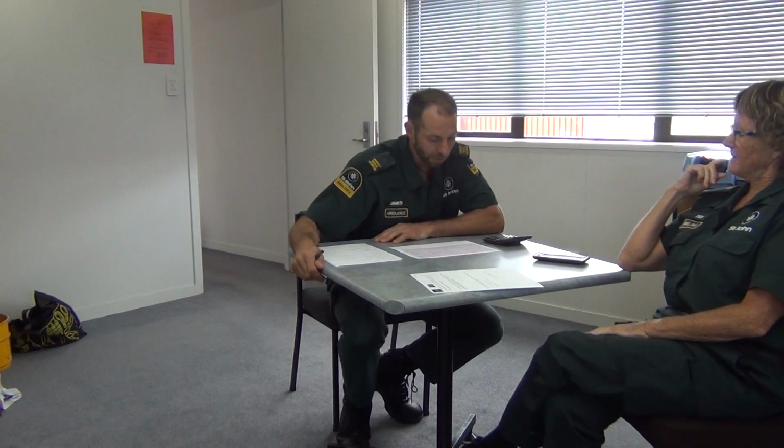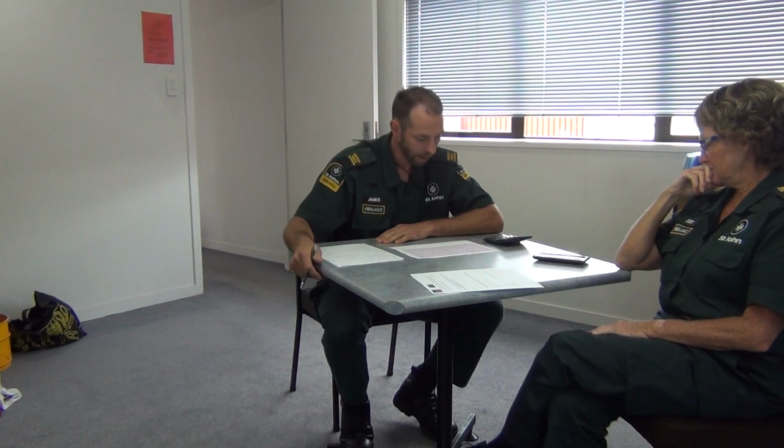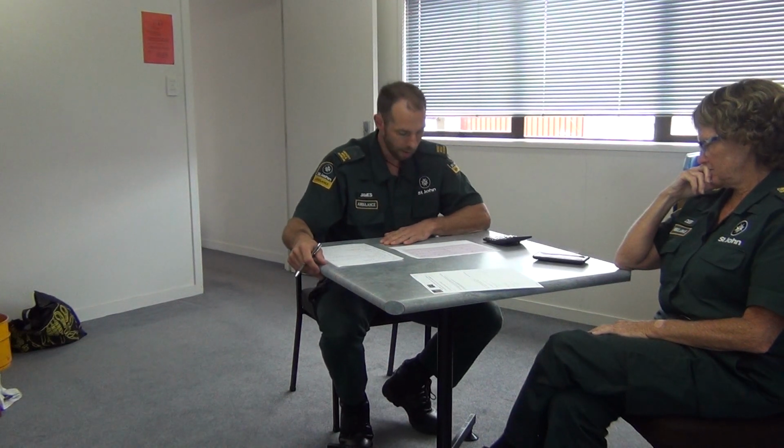Yep. Okay, so the first thing I look at is the AVR. The vector is negative. There is a QRS complex in every lead.